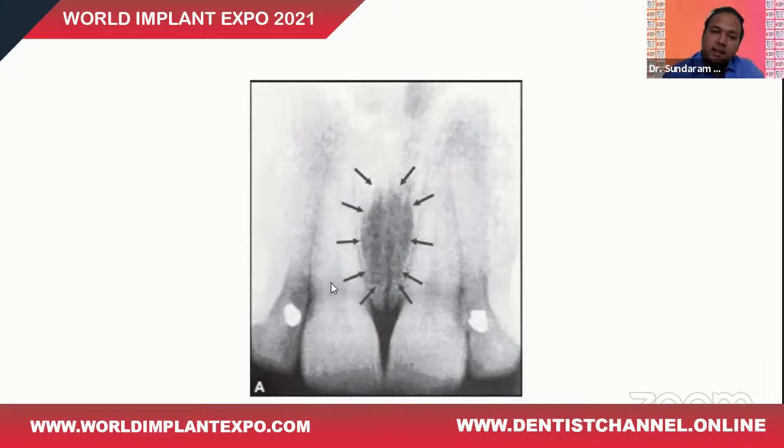And if my implant is going to come only up to here, then what about the crown that I will be placing on top of it? That will have a bit of mesial cantilever that would come up till here. And how deep is this implant going to be? Maybe up till here. Even then, I'm not completely aware of its dimensions.